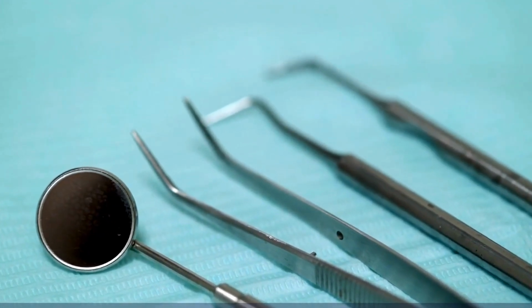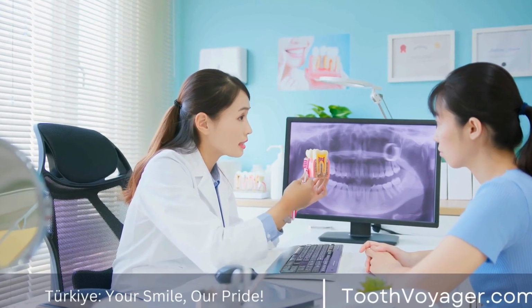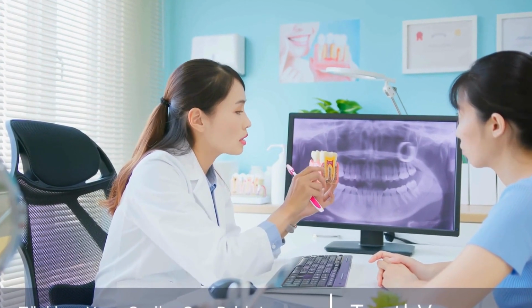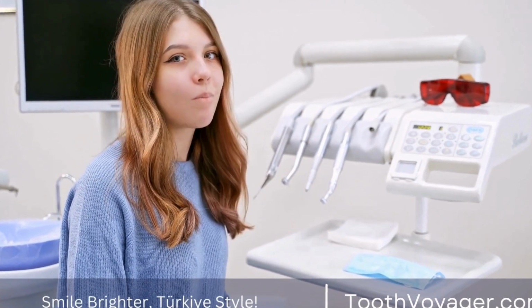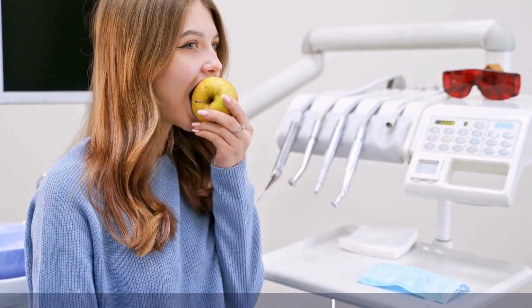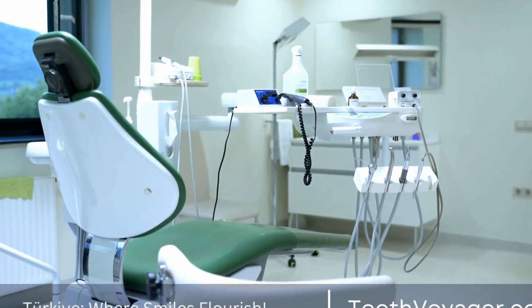1. Consultation and evaluation. The first step for getting dental implants is to set up the appointment with a dentist or an oral surgeon that specializes in dental implants. At the initial consultation, dentists will examine the health of the patient's mouth and determine if the patient is an ideal candidate for dental implants. Factors like dental health, bone density, and general oral hygiene are assessed.